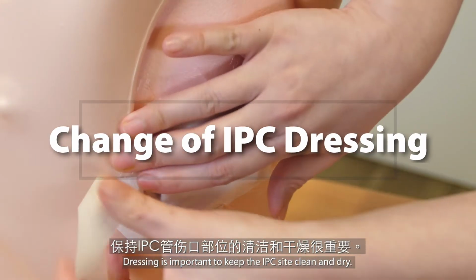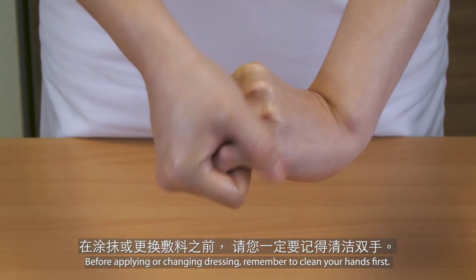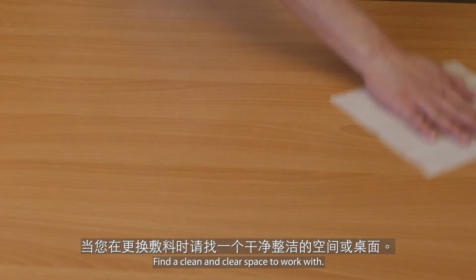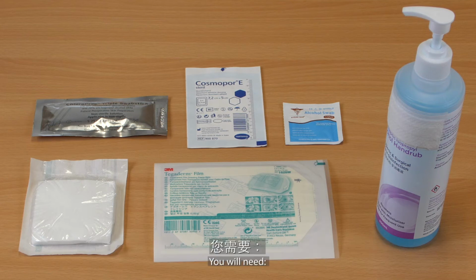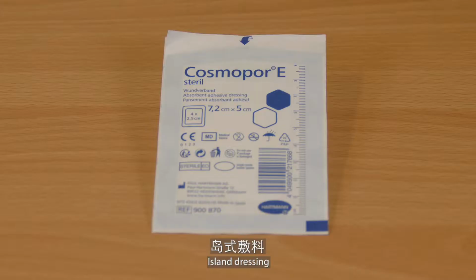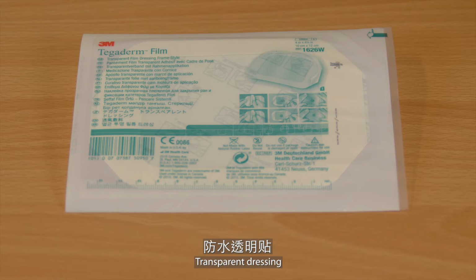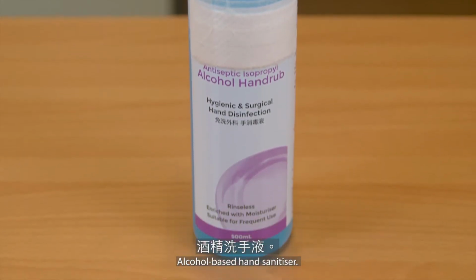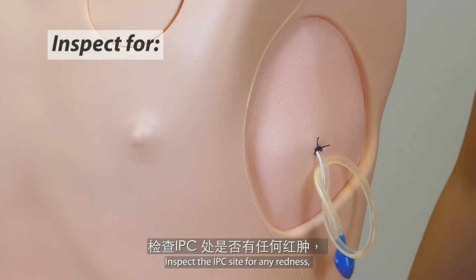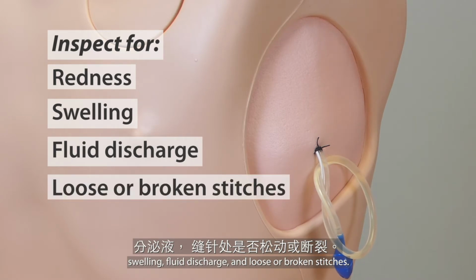Dressing is important to keep the IPC site clean and dry. Before applying or changing dressing, remember to clean your hands first. Find a clean and clear space to work with. You will need disinfectant swab sticks, alcohol swabs, island dressing, gauze, transparent dressing, and alcohol-based hand sanitizer. Remove the dressing to be changed.